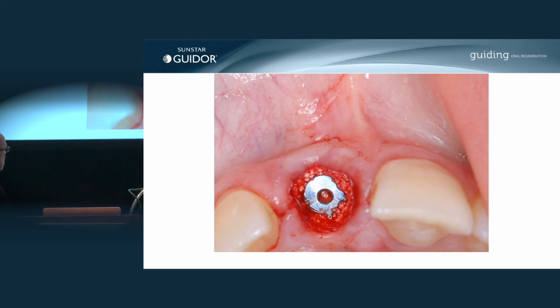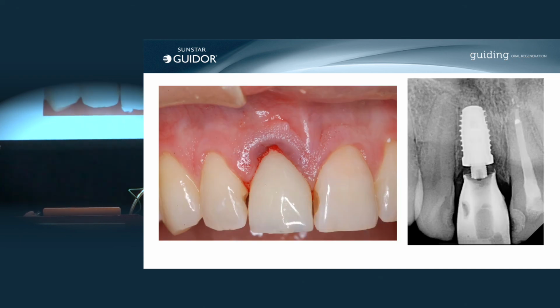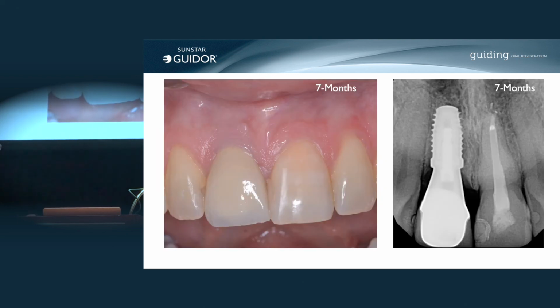The tooth was extracted. There was no flap and no suturing of the area, and the easy-graft was placed. Then they used the temporary at the same time to contain the material. And this is at 4 months.